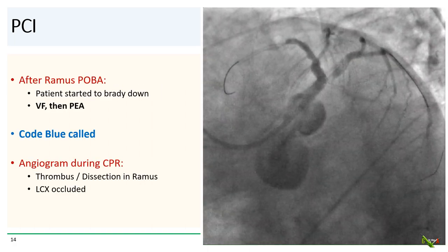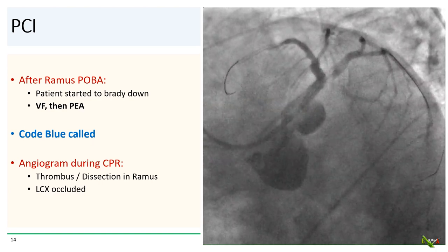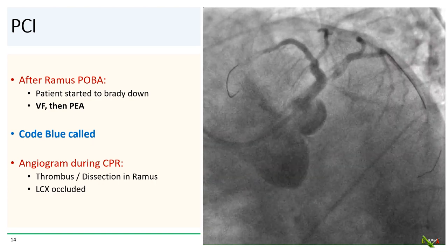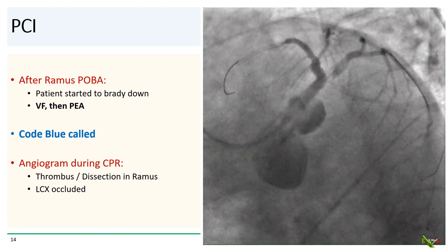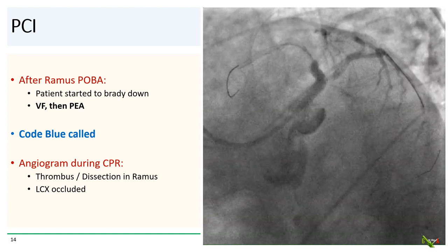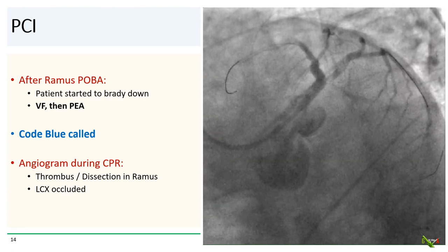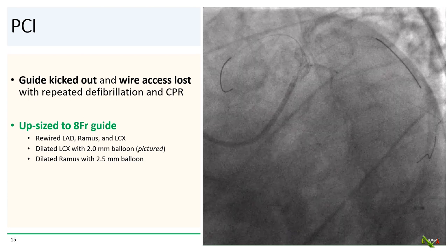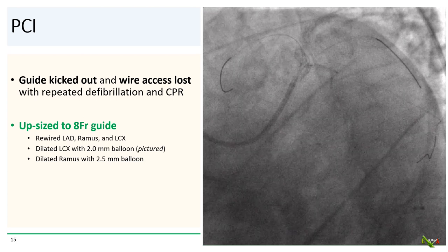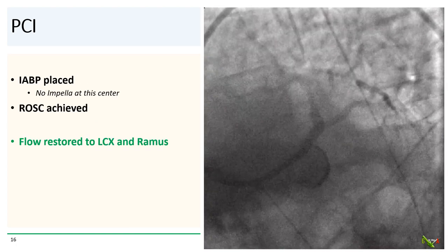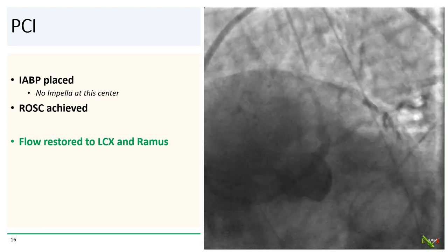But after dilating the ramus, the patient started to brady down. He then arrested — he had ventricular fibrillation, which was immediately shocked, and then went into PEA. Code blue was called and CPR was started. We took an angiogram during chest compressions, and as you can see, there was now sluggish flow in the LAD, thrombus and possibly a balloon dissection in the ramus, and the dominant circ was now occluded. With repeated defibrillations and CPR, the guide catheter kicked out and all three wires came out. We then decided to upsize to an 8 French guide, and under duress, in between chest compressions, quickly rewired the LAD, ramus, and circumflex. We were then able to dilate the circumflex with a 2.0 millimeter balloon and the ramus with a 2.5 millimeter balloon. Fortunately, at this point, we got ROSC back.